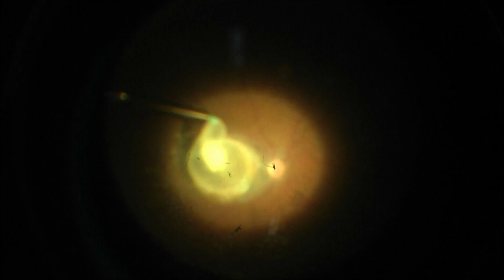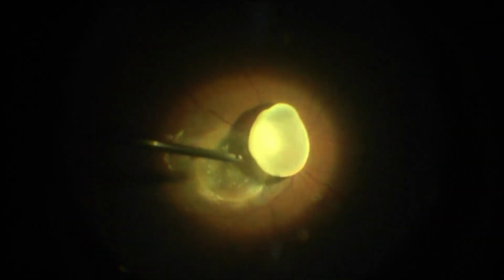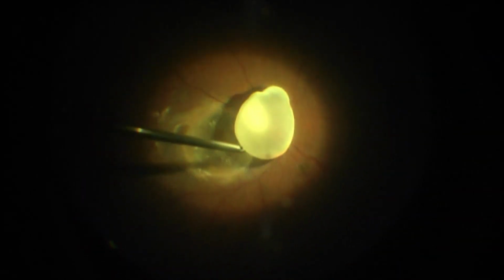Diathermy over the temporal aspect of the cyst was done and careful extraction of the subretinal cyst was attempted. With patient and gentle movements, the intact subretinal cyst was brought into the vitreous cavity. Quick aspiration of the cyst was done by the vitreous cutter.